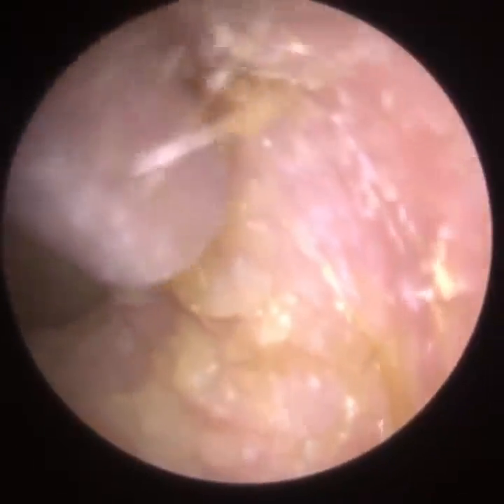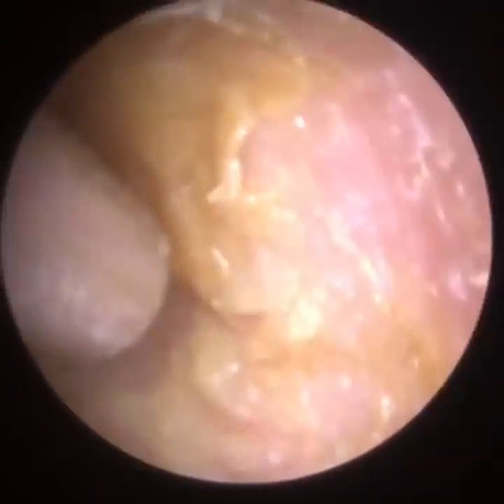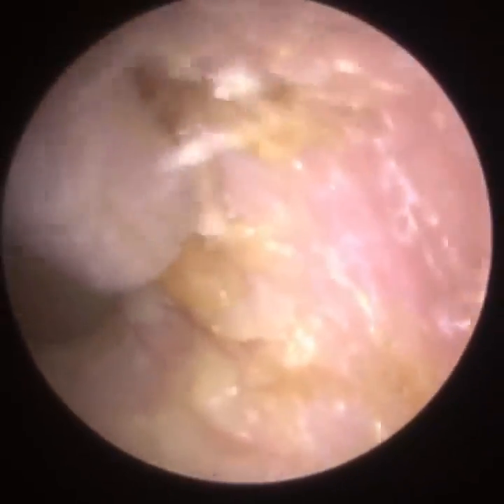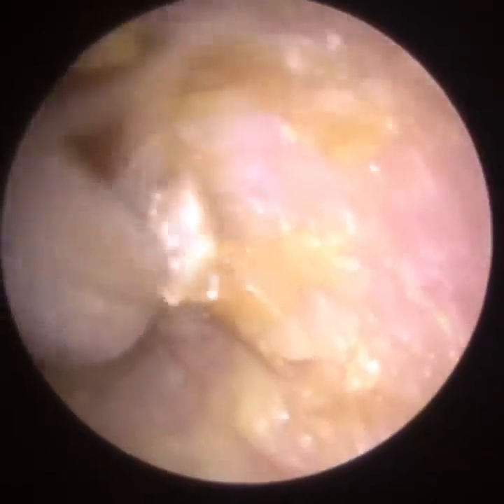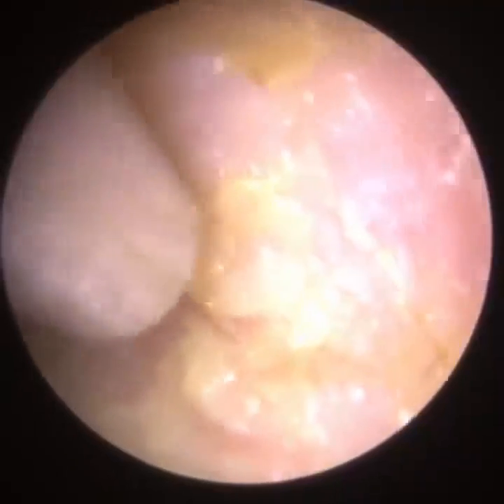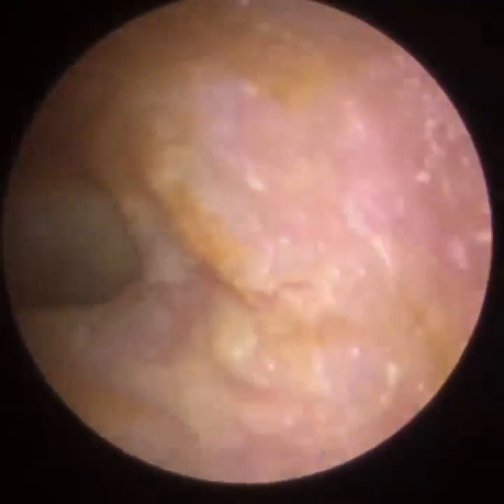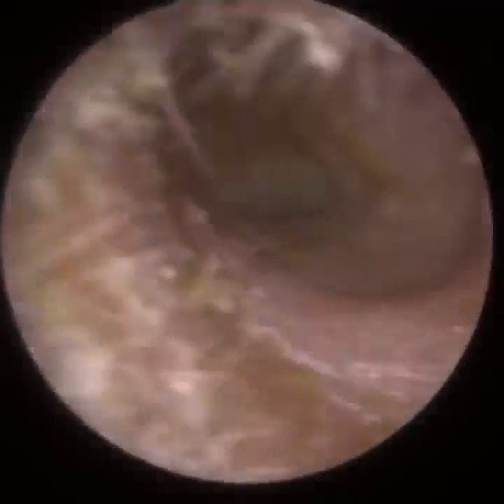At the moment, I'm just using a standard Zollner suction probe. Now, we're approaching the bony part of the ear canal, so here I'm just being extremely cautious. And it's a very tedious procedure. When we remove the dead skin and discharge, it does give some patients some short-term relief. However, they are still suffering from otitis externa. Suctioning the ear doesn't get rid of any bacteria or fungi which is causing this. We're just cleaning the ear.